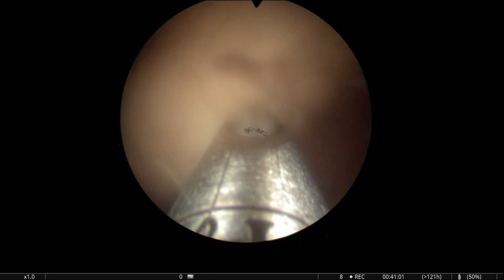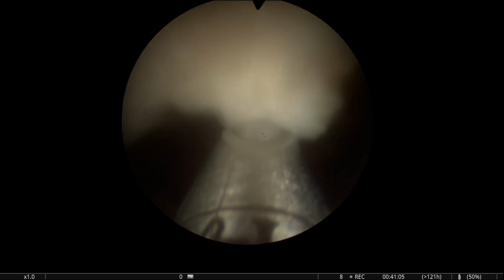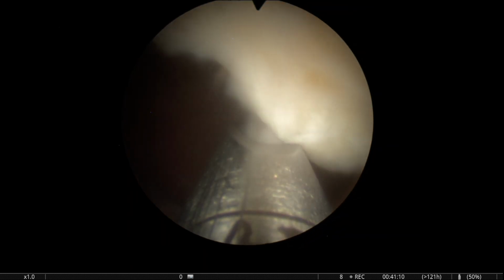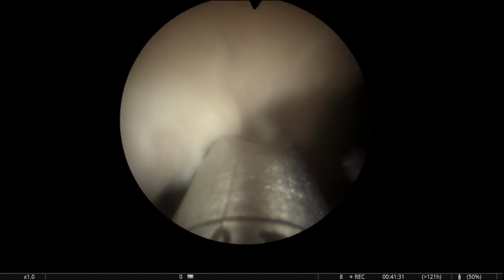You will have very low stress incontinence rates, and if there is incontinence, it's going to be mild and very, very fast. It will disappear, and you will make a very, very high proportion of your patients happy by the development of your skills. Also, I think being effective and doing faster operations reduces the stress on the urethra.